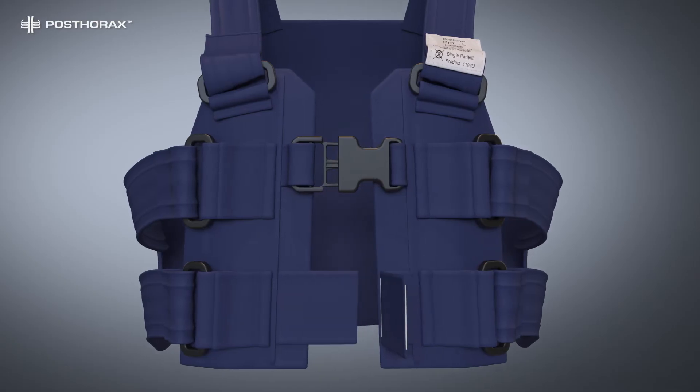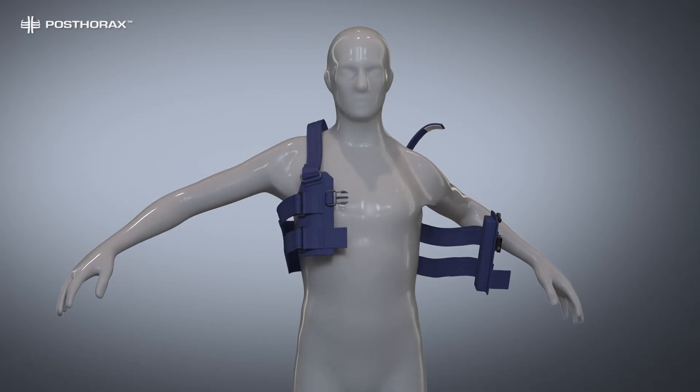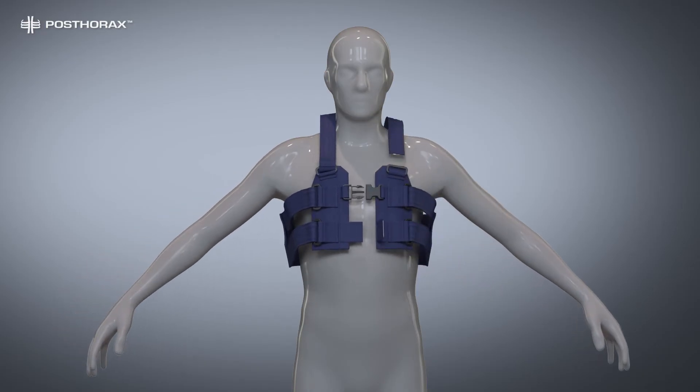Open the front buckle and velcro and one shoulder strap. Place the patient's arm in the closed shoulder strap. Close the other side, as demonstrated.